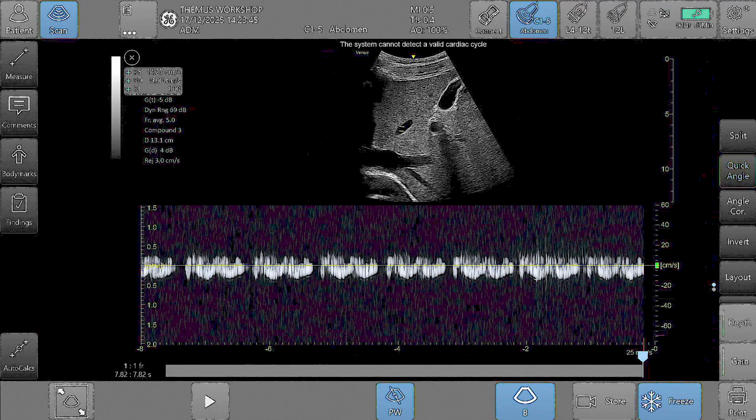Any questions? Sometimes I try to do the VExUS in the emergency setting, but the emergency patients cannot hold their breath and they breathe so fast. Yes. If the patient cannot hold the breath, you need to just take the spot, maybe for just one or two waveforms only, because the vessel will move, right? So in that case, maybe you can increase the sweep speed, and when the vessel comes in you have the time to take at least one waveform to do the analysis, because only when the patient can hold the breath can you get a beautiful view for consecutive waveform analysis.